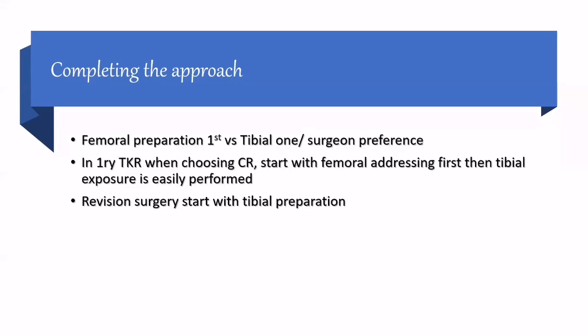But we will have some discussions in the revision surgery in the next few webinars. And I hope we will all be in touch. As in the revision surgery, after removal of the component, they will start with the tibia first procedure that creates a flexion gap, using the tensors.